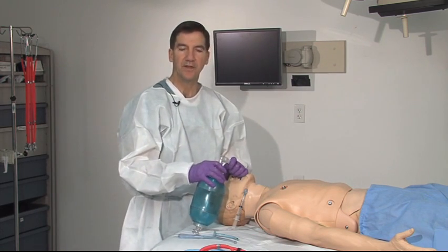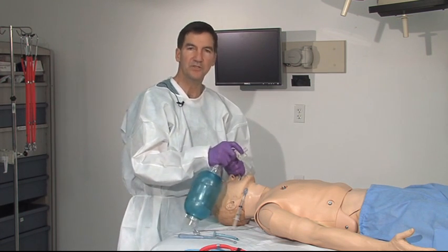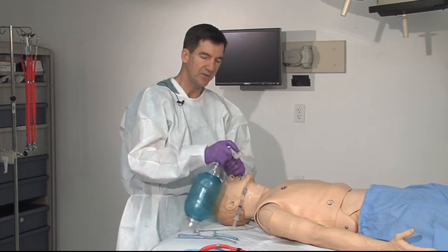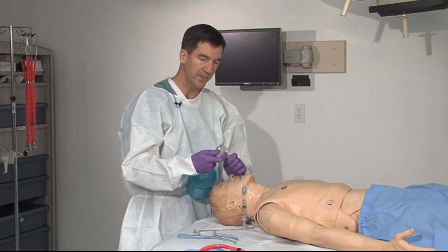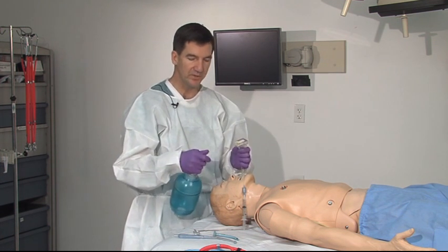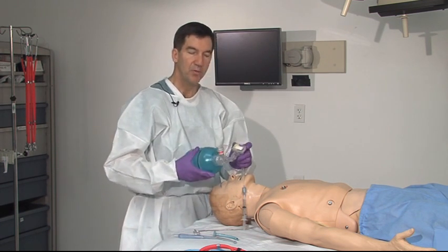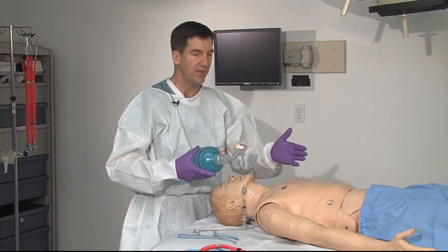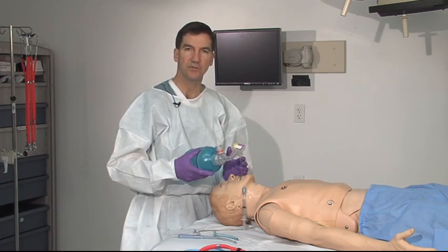An additional device is the end-tidal CO2 monitor. Once the patient has been intubated successfully, this device allows you to double check and make sure that you're in the trachea. By placing this device between the endotracheal tube and your bag, you're able to watch for a color change that witnesses the CO2 level rising with your resuscitation.